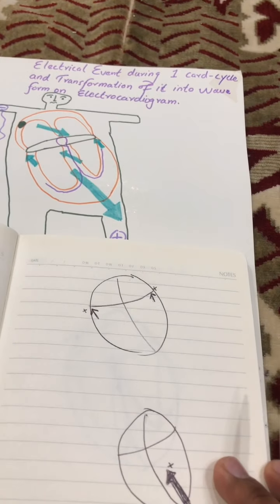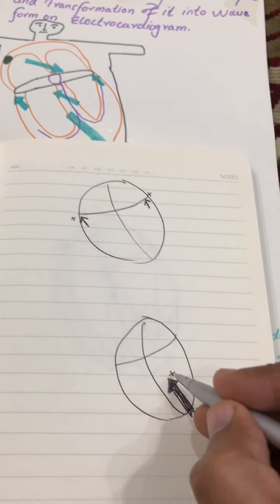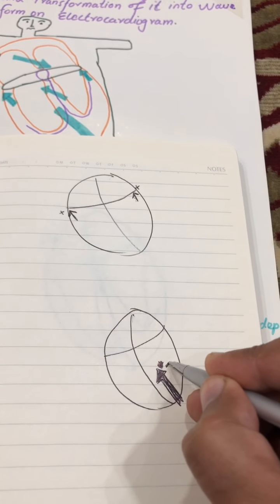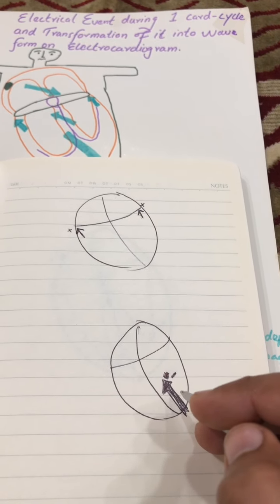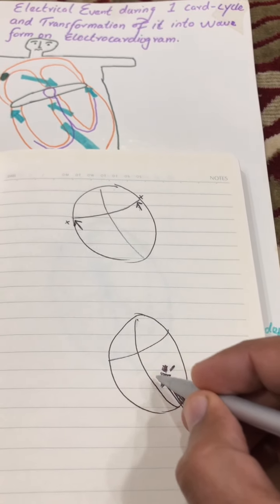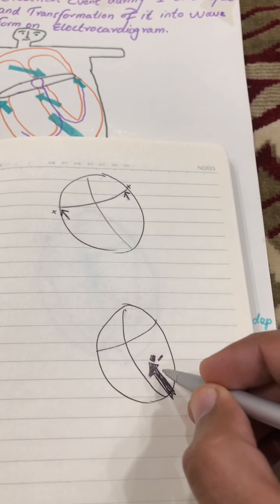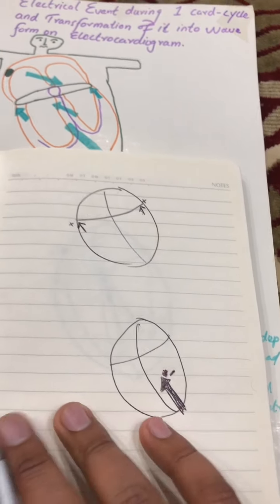See, after that the wave of repolarization is going to start. This is the repolarization wave, so sorry, repolarization wave is always negative, and the repolarization of the ventricle is from down to up. Okay, depolarization is like this in the ventricle, and repolarization is always like this. Okay, so remember this thing, because we're gonna apply it on the normal physiological form of the ECG.